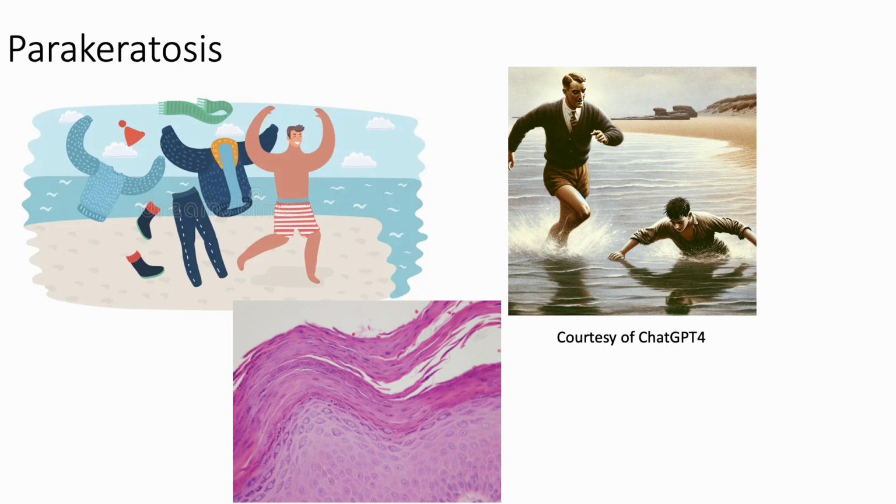This guy, maybe he has time to take off all the clothes and jump into the sea. Instead, this guy on the right is in a rush to save someone who is almost dying in the water. So he does not have time to take off the clothes. So that's the difference, retention of the nuclei.